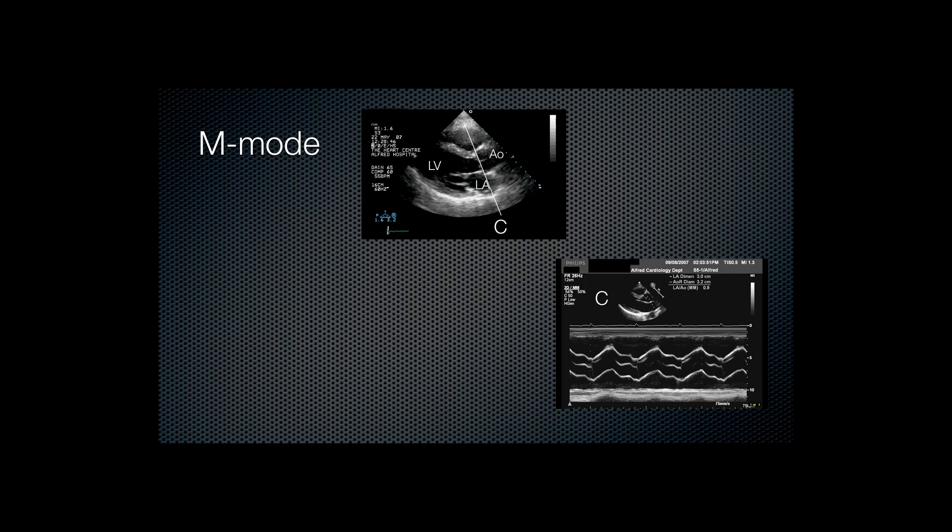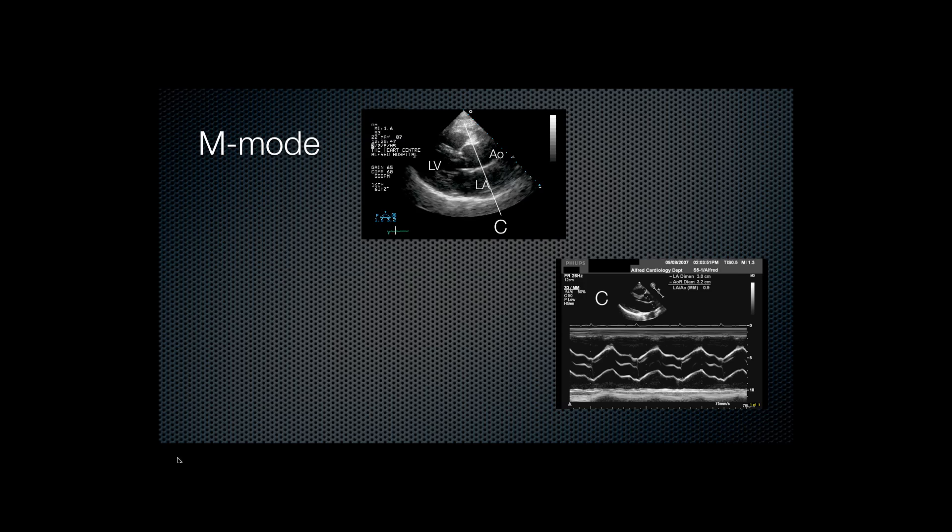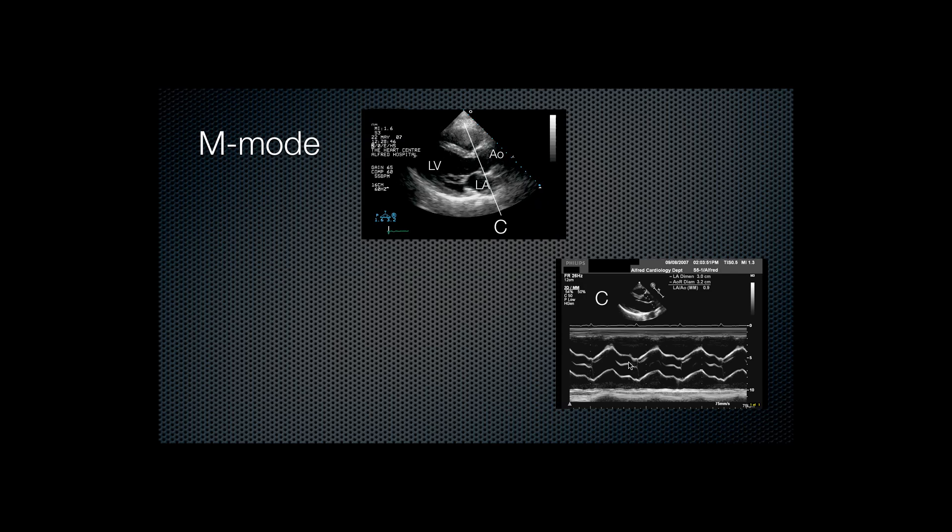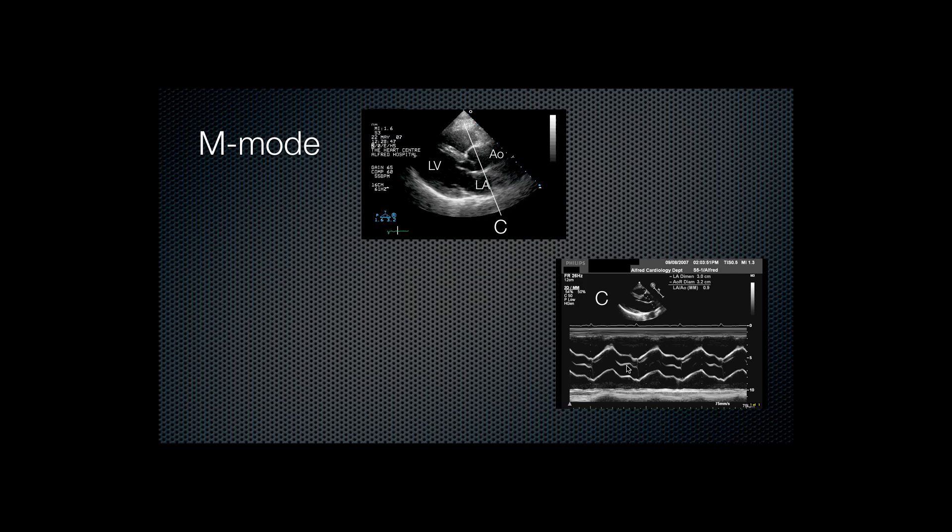Line B passes through the mitral valve, so the motion of the mitral valve leaflets can be seen. Line C passes through the aortic valve, so here the opening and closing of the aortic valve can be seen.